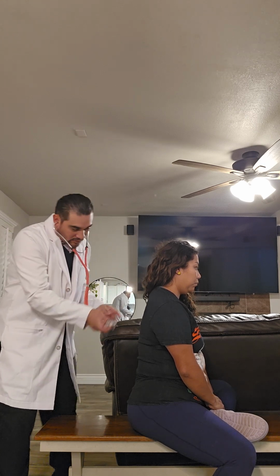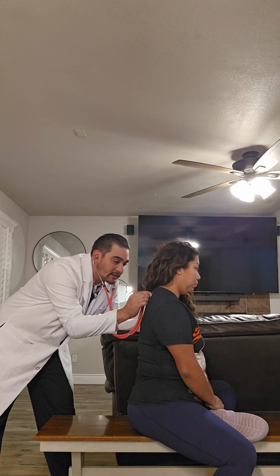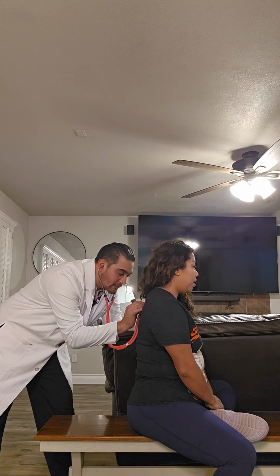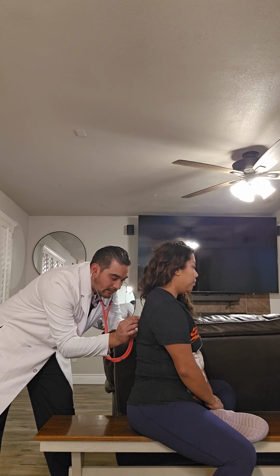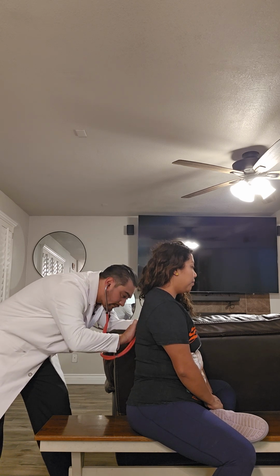So I'm going to auscultate the different portions of the lung at this point. Go ahead and say 99. 99. Again. 99.